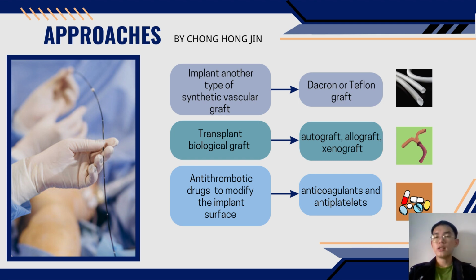Antithrombotic agents such as anticoagulants and antiplatelets, which are immobilized on the product surface, can be used to eliminate or reduce the risk of blood clots. Anticoagulants such as heparin will activate antithrombin that inhibits thrombin and factor Xa, which prevents clotting. Antiplatelets such as aspirin help in thinning the blood and preventing the development of clots.